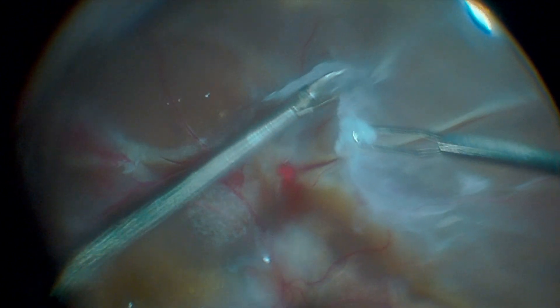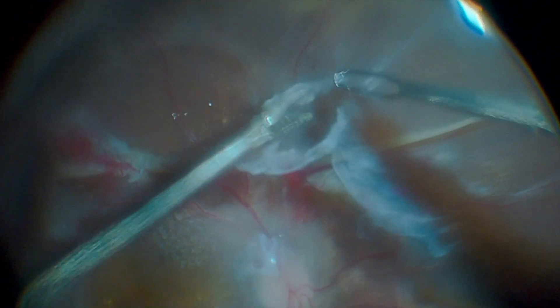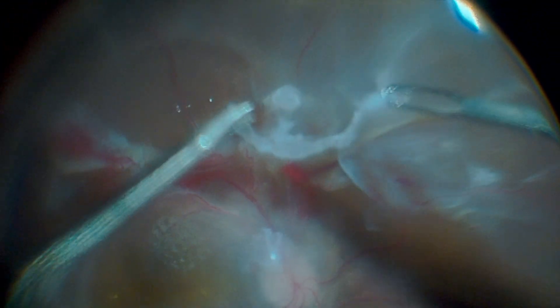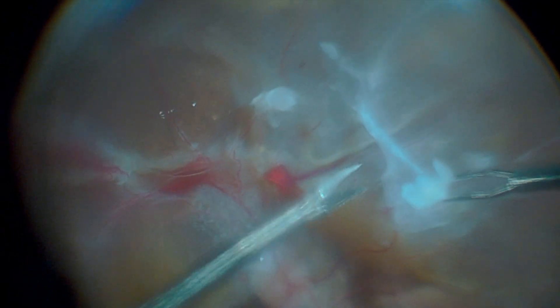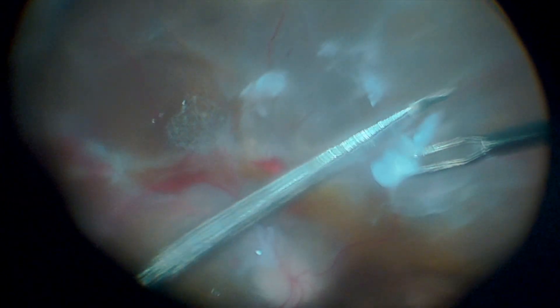Care must be taken when using the scissors, as an iatrogenic retinal tear can make it much more difficult to remove the hyaloid, compromising the postoperative prognosis. As the membranes are released, we can observe an improvement in the retinal appearance. The main challenge in these cases is to find the correct dissection plane for the membranes, as the retina underneath is detached, which makes inadvertent tears more likely.